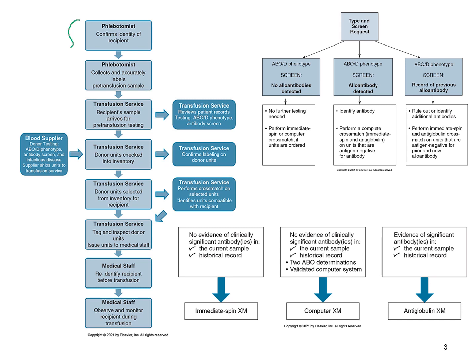Whoever is responsible for this, like I said, phlebotomist, nurse, medical assistant, whomever is trained to do the collection, is going to confirm the identity of the recipient. So there's usually some kind of armband, photo ID, some sort of identification to make sure that that patient is who they are.